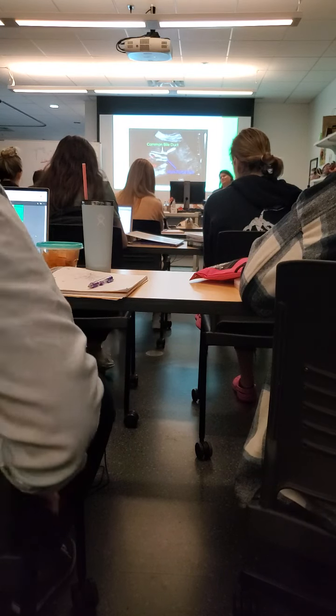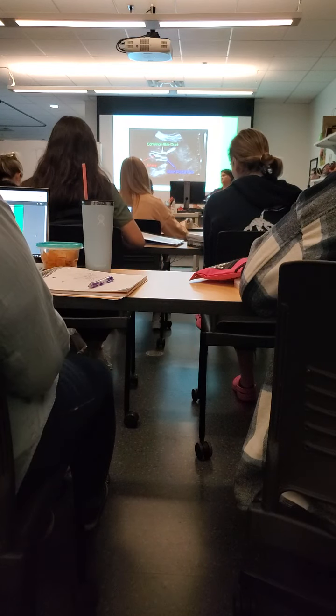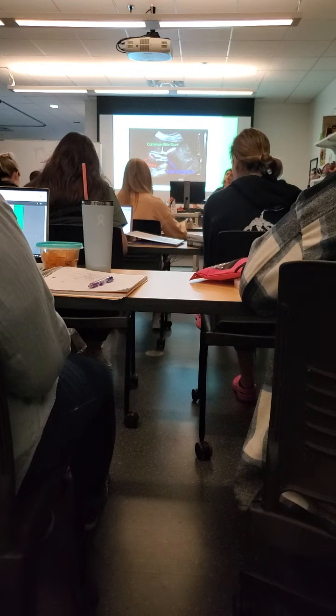When you said that you'll be able to elongate it all the way to the pancreas, would that be from the liver all the way to the pancreas? Yeah, so what you'll do is you'll find the largest part of the common bile duct and you'll measure that. And then usually when it tapers down into the pancreas, you're going to measure the distal end. So you measure the proximal and distal end. You can take it in one image if you can get it, but usually with normal body habitus you have to take 2 images to get it going into the pancreas. It should be small going into the pancreas, a little bit larger proximal, smaller distal.